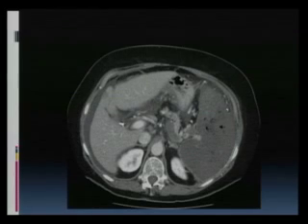This is a normal phenomenon. If you see this kind of air on CT, this is post-embolization. Do not worry that this is an abscess. An abscess looks very different. It is going to be round, with areas of air there. This is air in the arterial system, okay? But what you need to realize is this portal thrombus.